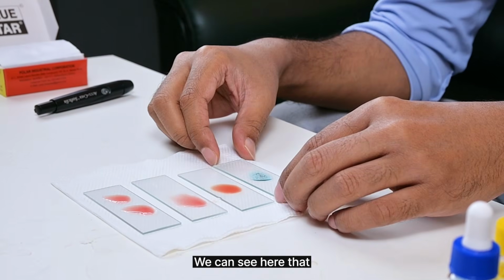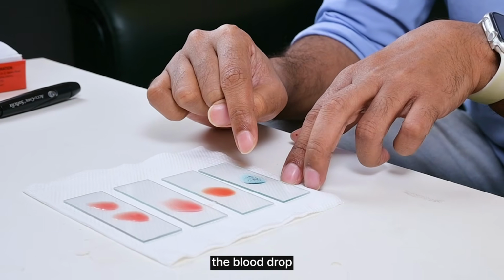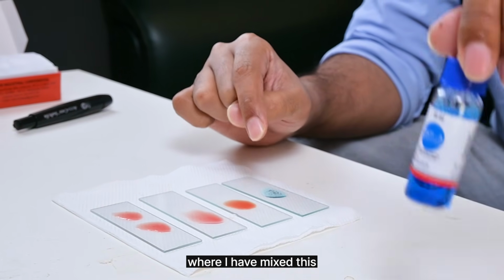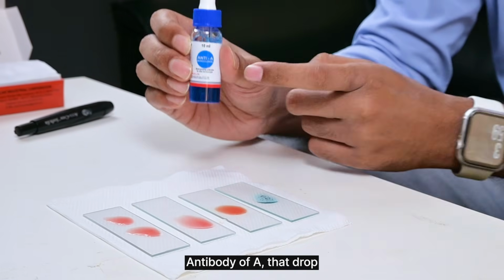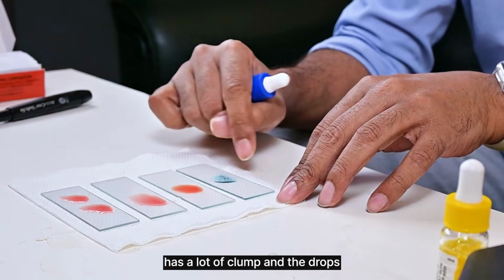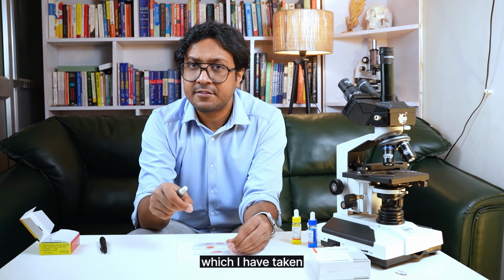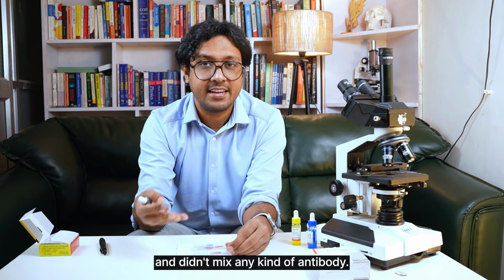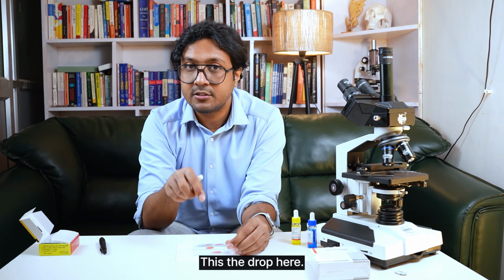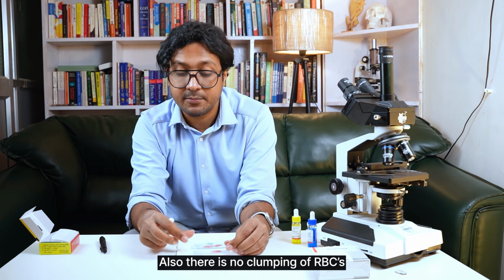We can see here that the blood drop where I have mixed the antibody of A has a lot of clumps. And the drops where I didn't mix any kind of antibody also show no clumping of RBCs.